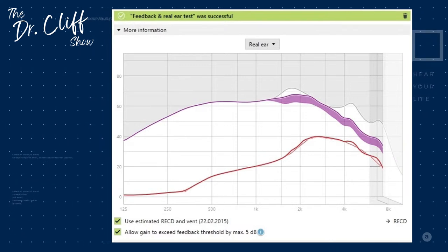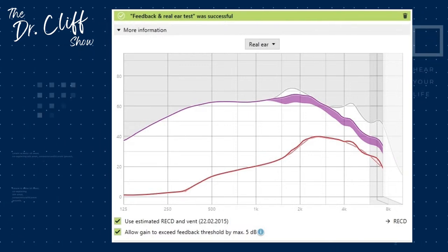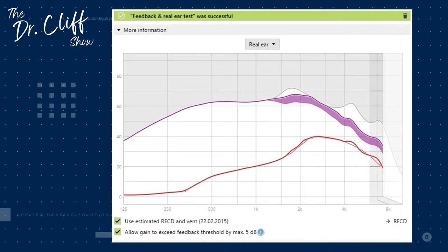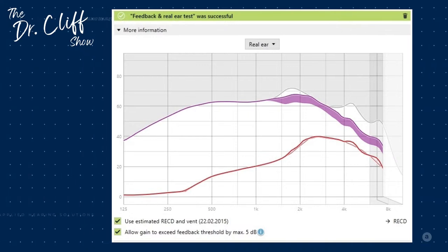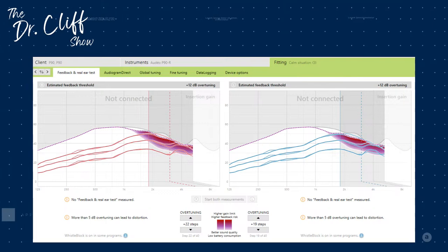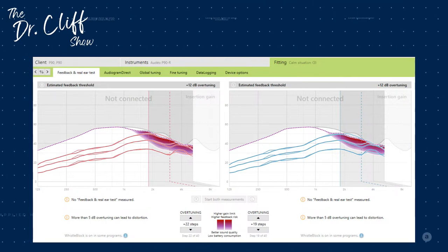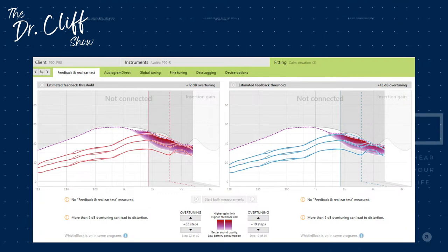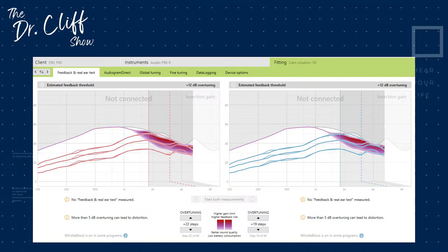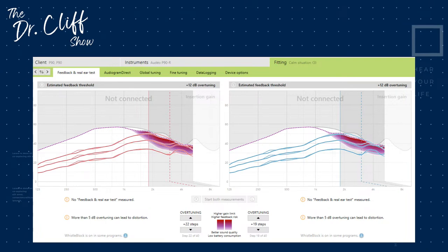Right. Now, this doesn't normally end up this pretty. Sometimes we end up with a significant amount of feedback risk detected by the software. And so then we end up with an image where the purple curve that you see on the screen is really starting to run into those red and blue lines. The red and blue lines are signifying how much amplification is coming out of the hearing aid at that specific frequency range that's needed to overcome the hearing loss. However, if it creates that level of amplification, it's going to fall out of the ear and get picked up by the microphones. So the hearing aid will actually limit its output to not go above that threshold, but if above that threshold is where you need it to be to hear, then you're sacrificing clarity.